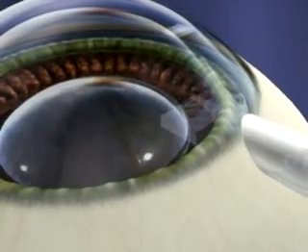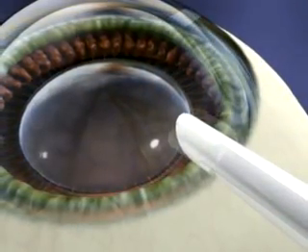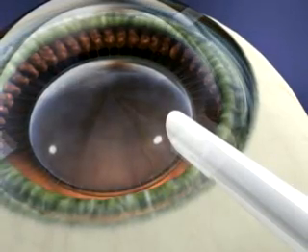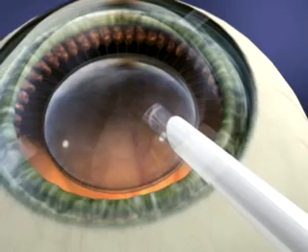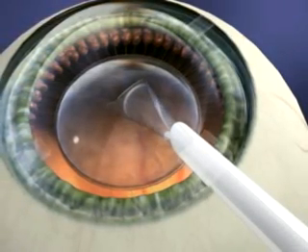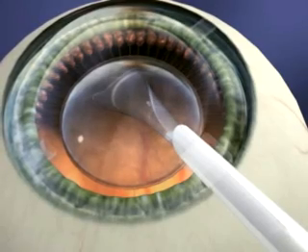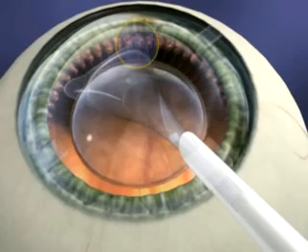You are now ready to inject the ICL. Place the tip of the cartridge, with the bevel down, just inside the incision. Slowly inject the ICL using a tapping motion until the leading right landmark is visible. The ICL will unfold in a slow and controlled manner. Do not fully inject the ICL until you see the landmarks.